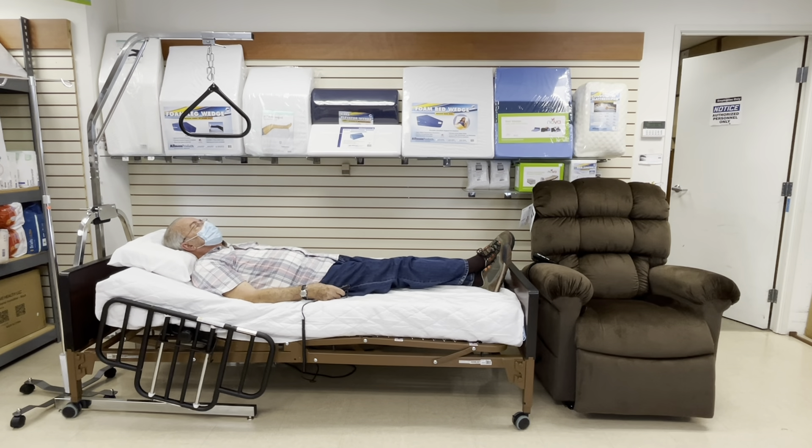Hello and welcome to Horton and Converse Medical Supply. Today we'll be going over our Delta Ultralight 1000 bed from Drive Medical.